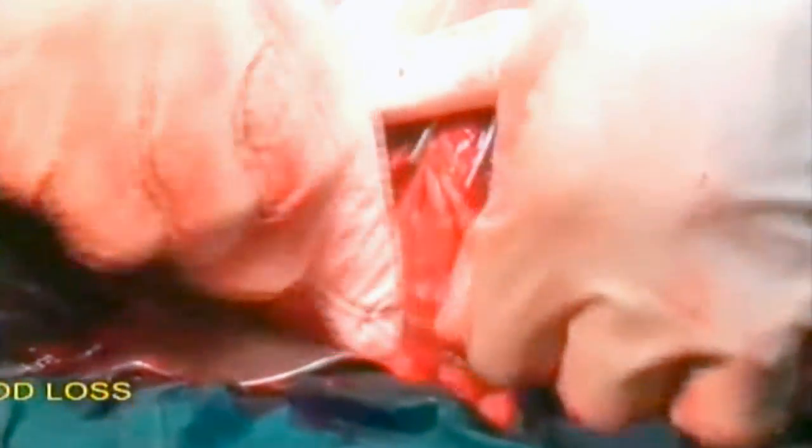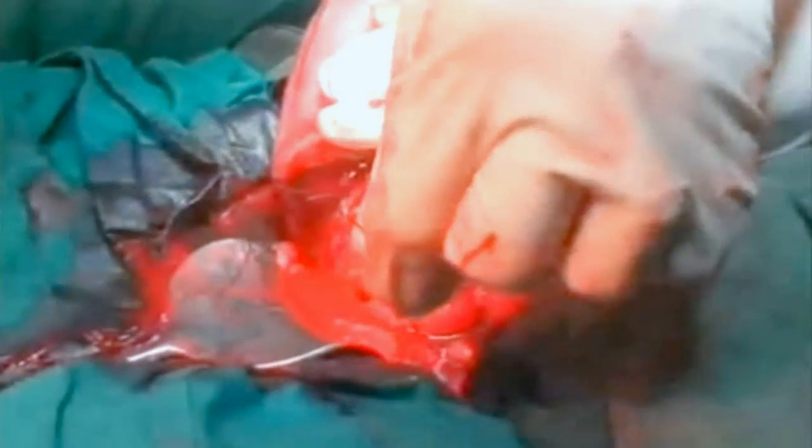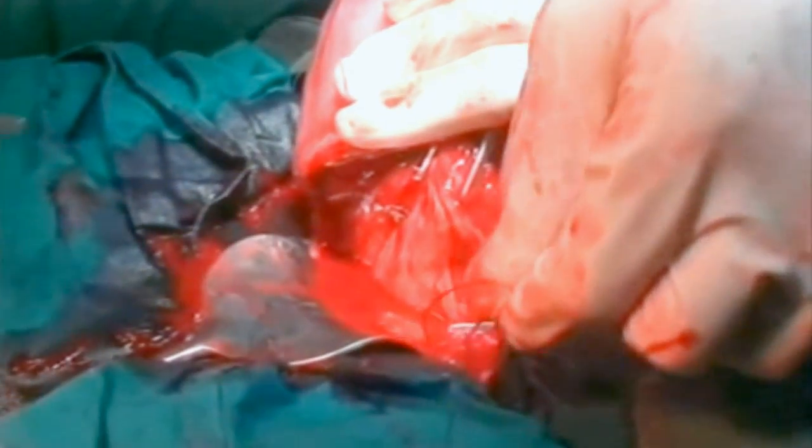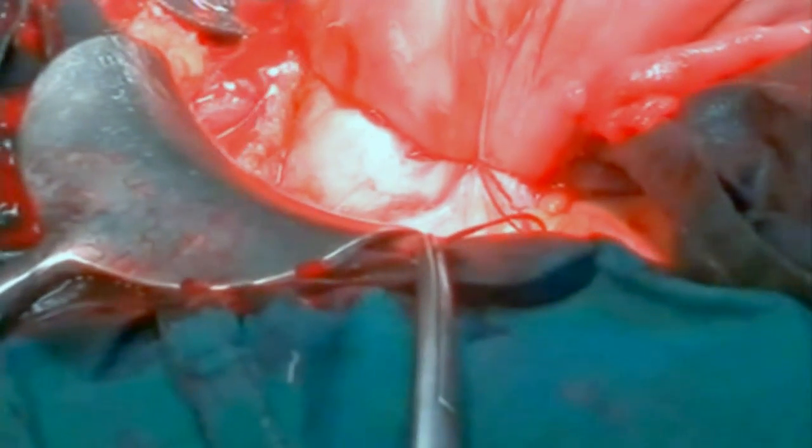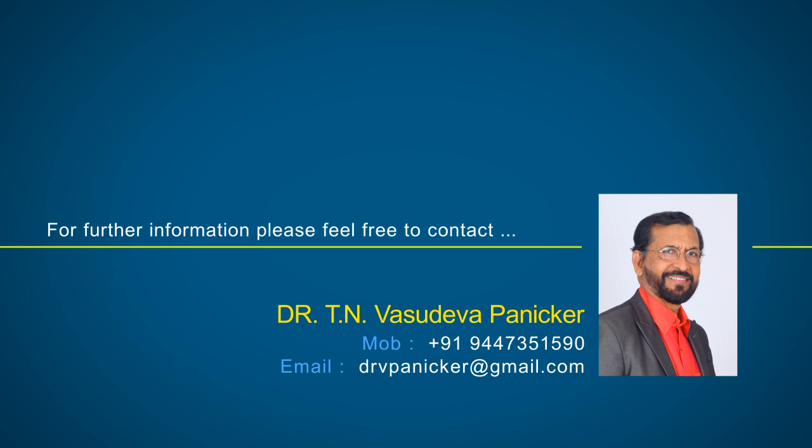You can see the tight knot there. Not even a drop of blood will be going into the uterine cavity. This can be finished within one to two minutes and a life can be saved. The PUL forceps is the only thing you need for successful suturing. Thank you.